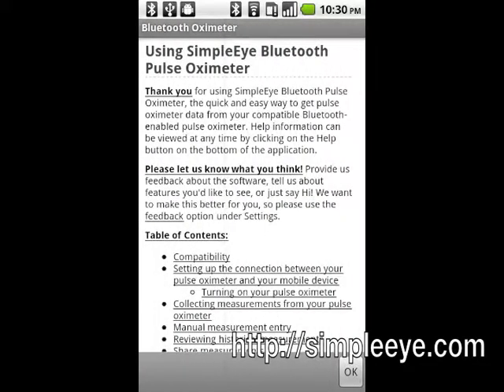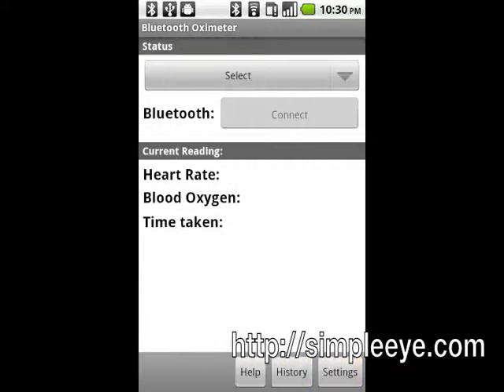The help screen will be shown. Tap OK to continue. You can tap the Help button on the measurement recording screen at any time to see the help.